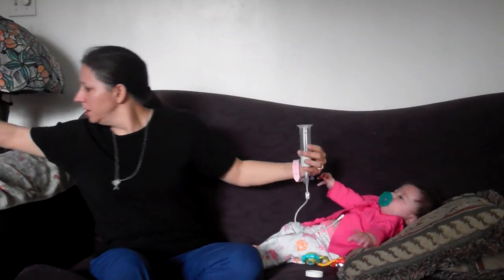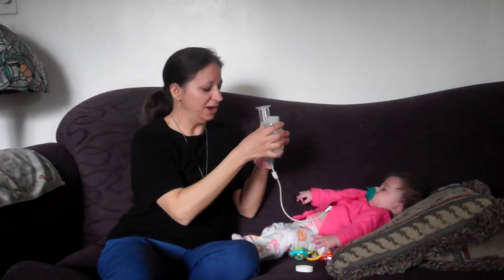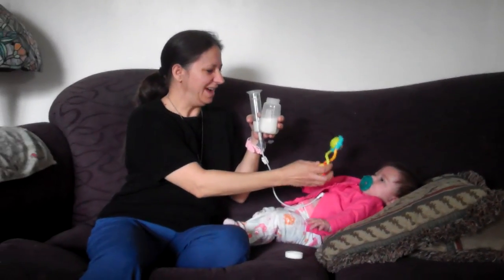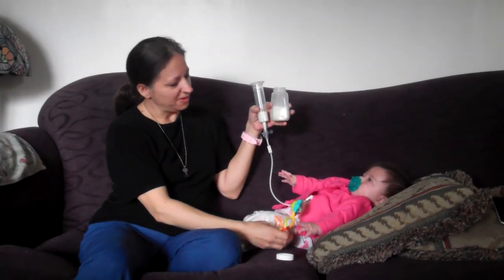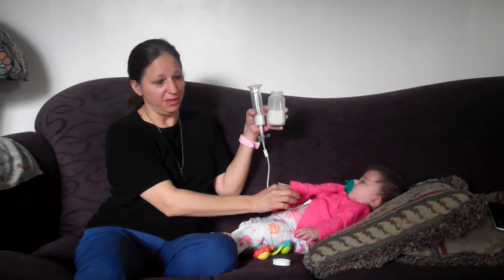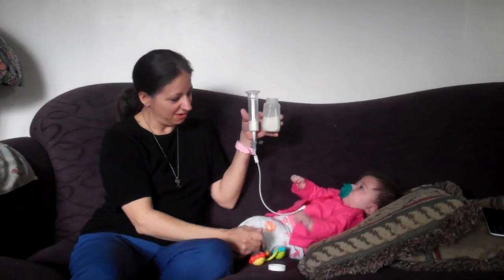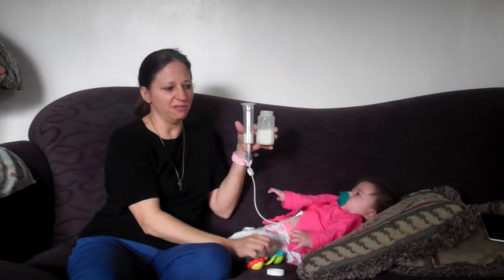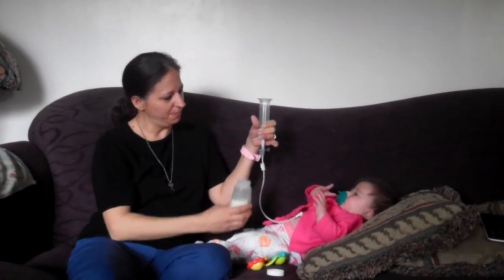Now, with Hannah, because she's getting to be such a big girl and grabbing things, I try to make sure that I have a little toy or something that she can play with if she wants it, so she doesn't grab the tube. And other times, if they're grunting or they're tightening up their belly, you're going to find that they can push this all back up, and you can have that milk go all the way back up here again. So sometimes I'll clamp it then, or I'll distract her with my fingers or find something to distract her and get her attention so she will relax those stomach muscles and not be pushing it back up.